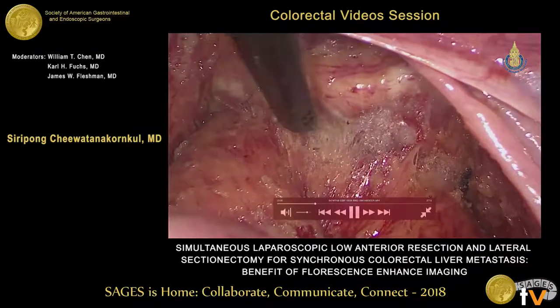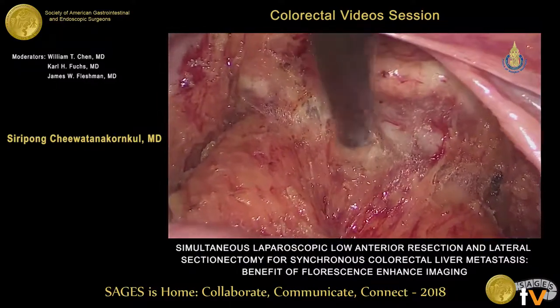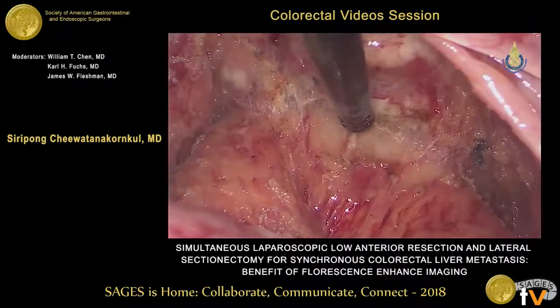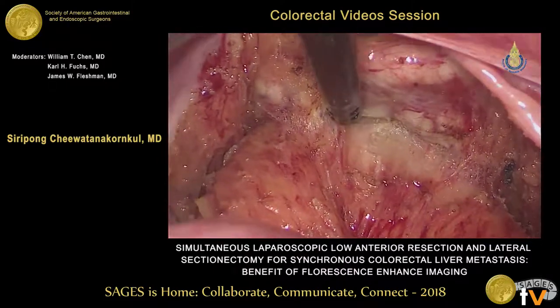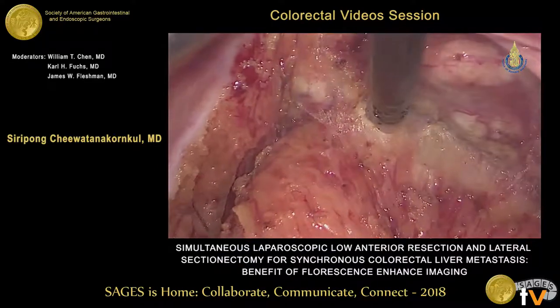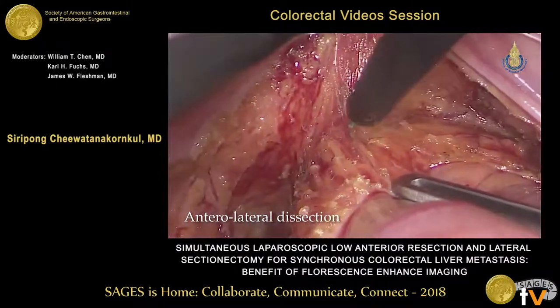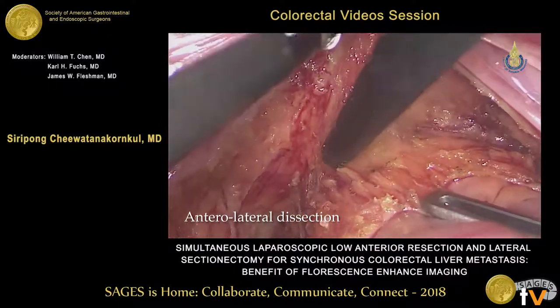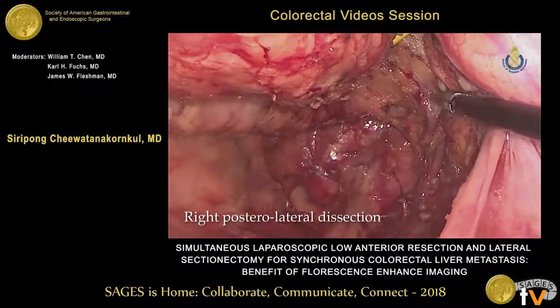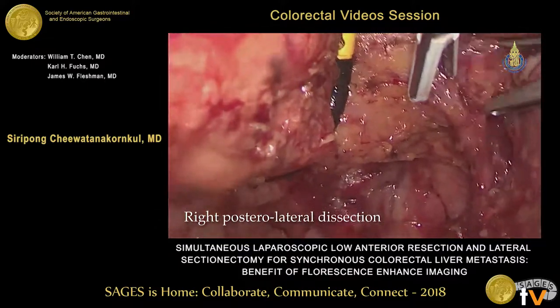As you see here, you can see a very beautiful view of the seminal vesicles. You can see the seminal vesicles clearly, and you can appreciate the fascial plane here — we go behind the Denonvilliers' fascia here. At the lateral section, care should be taken not to injure the nerve at the pelvic side wall. Here is the anterolateral dissection; the nerve should be sitting here. And then we go back to the posterolateral dissection. Then we denude the rectum.